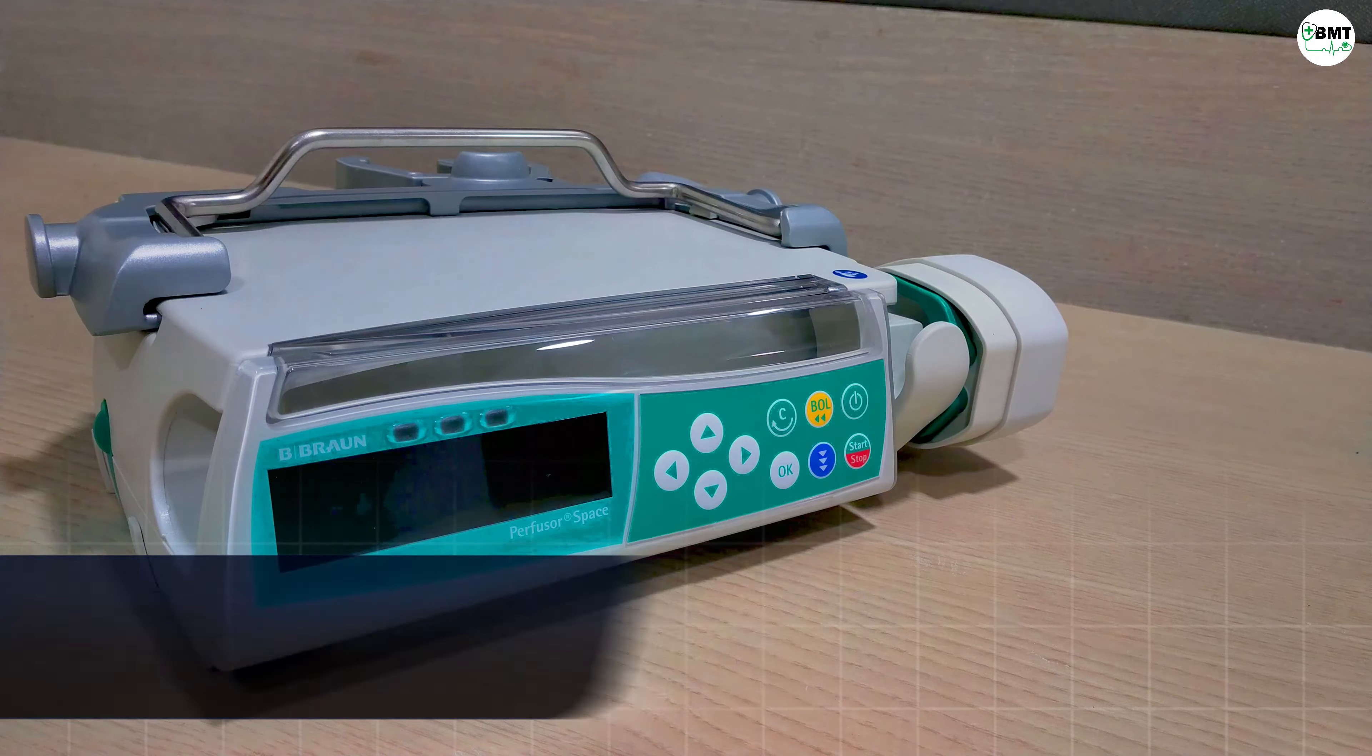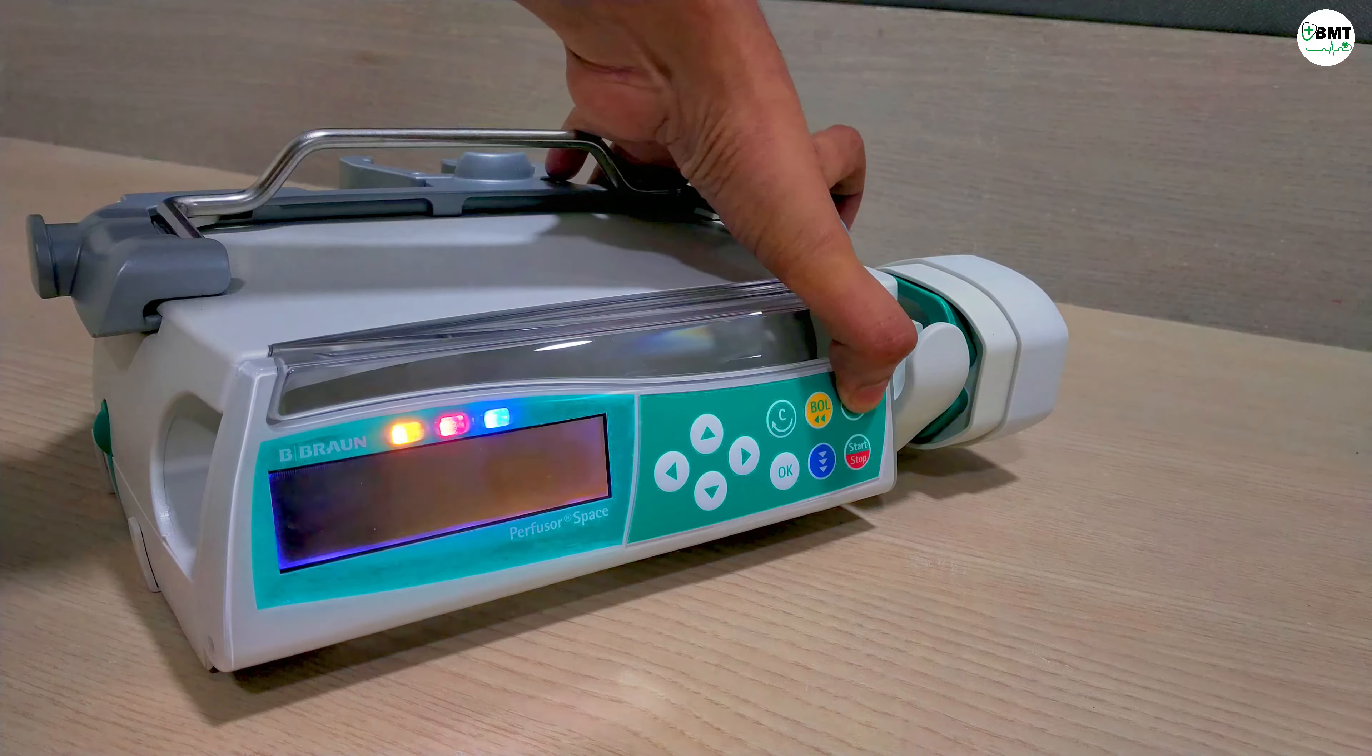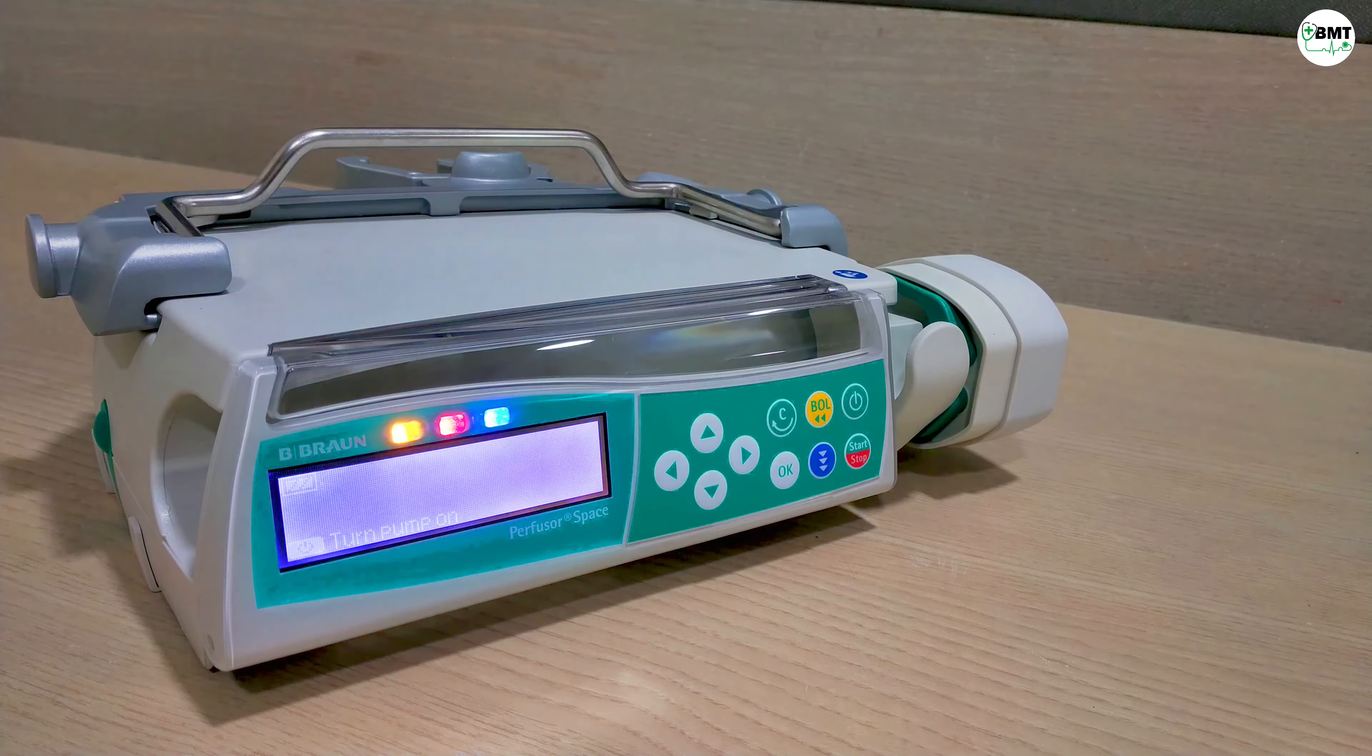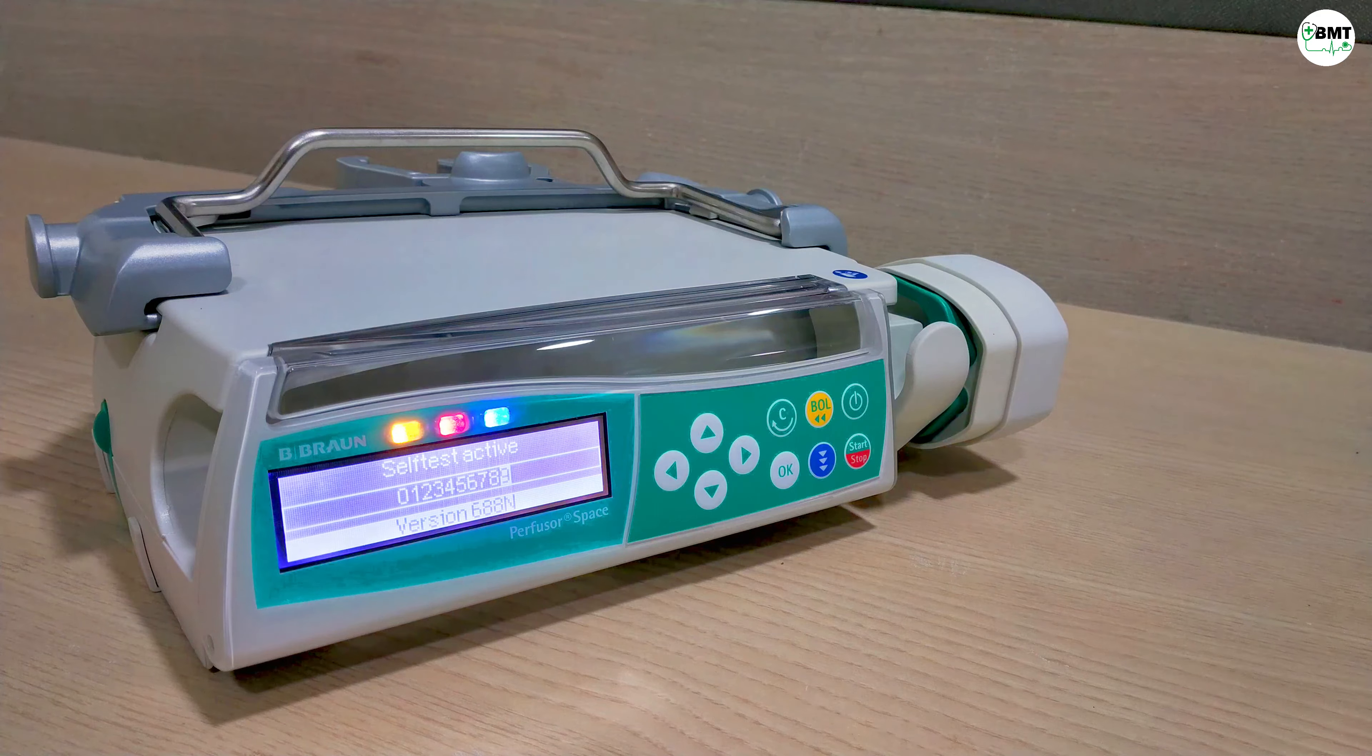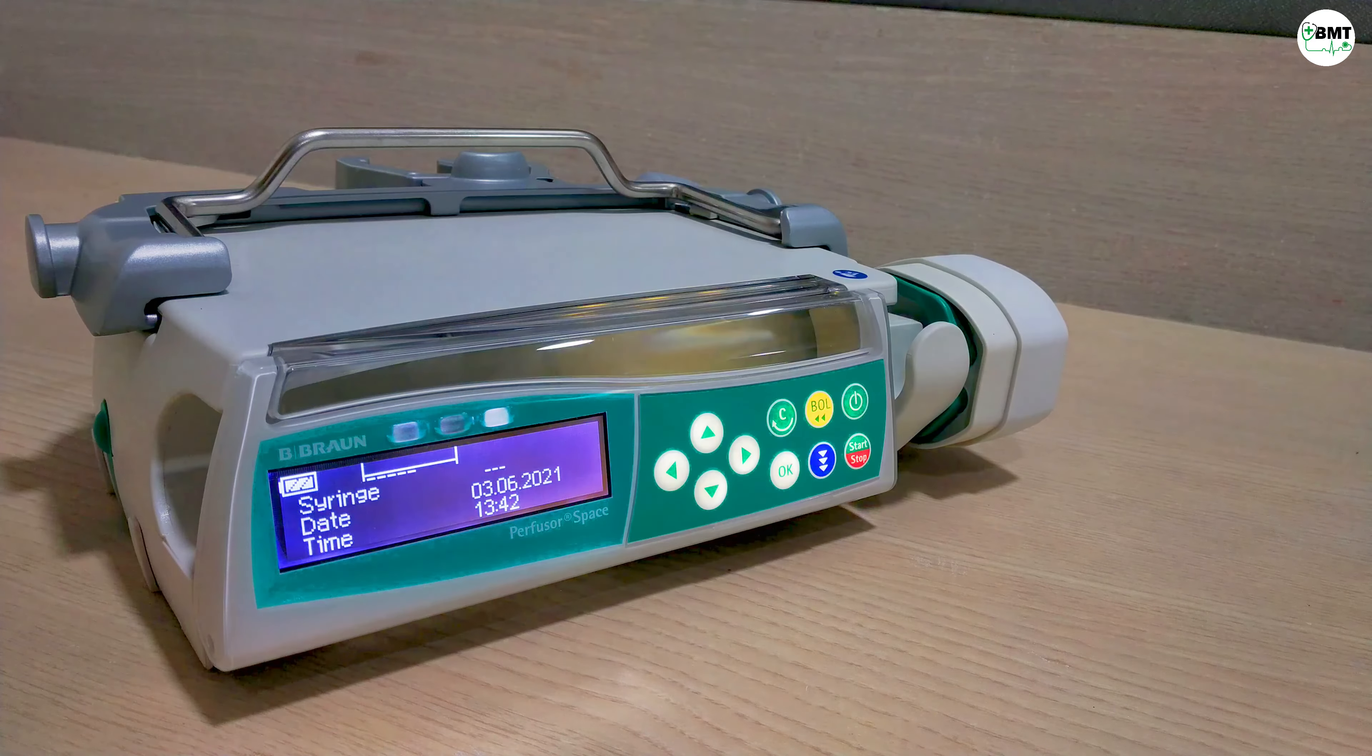This is B. Braun syringe pump Perfusor Space. This is the on-off switch. Turn it on. In the starting it will do a self-test.